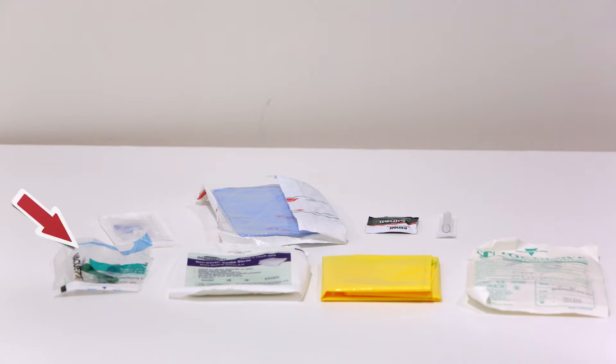One safety blood collection set complete with green butterfly needle, holder and luer lock. One spare blue butterfly needle just in case a different size needle is needed. A pack of five gauze swabs, a yellow plastic bag and an adhesive stick.